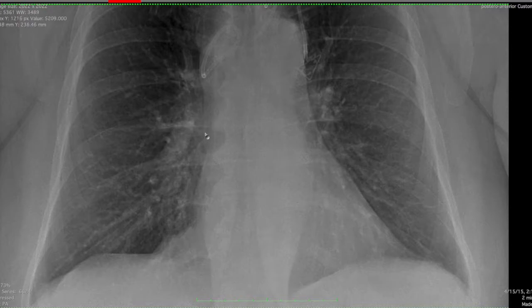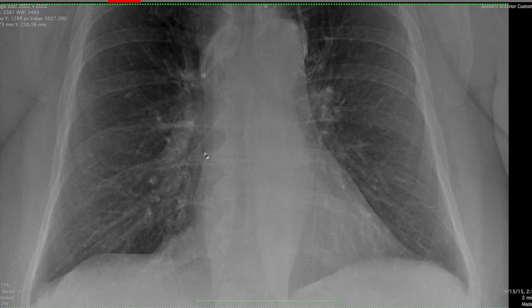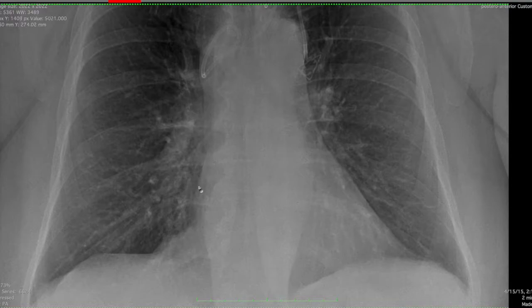Remember the cavoatrial junction — there are two nice landmarks that I use. So you follow the bronchus intermedius, and where that joins up with the right heart border, that's very close to the cavoatrial junction. Some people use the convexity of the right atrium, because this convexity is comprised mostly of the right atrium, and where that evens out and joins up with the superior vena cava — which is straight up and down — that would be the cavoatrial junction.